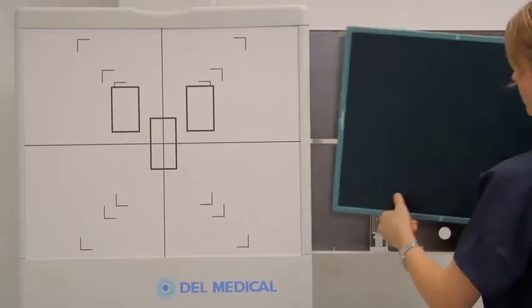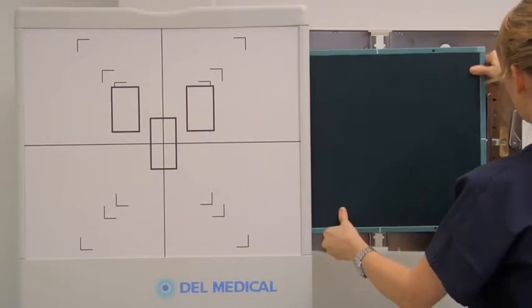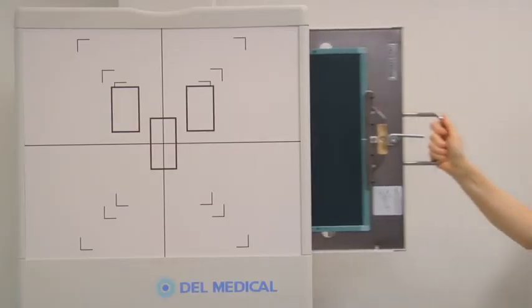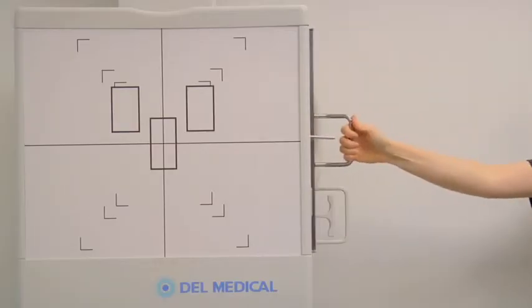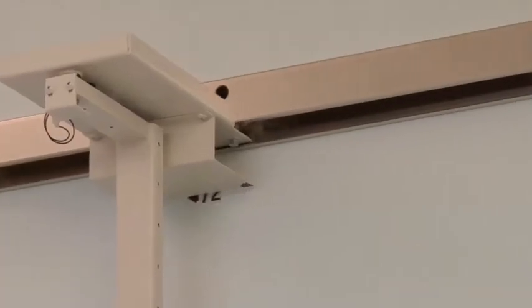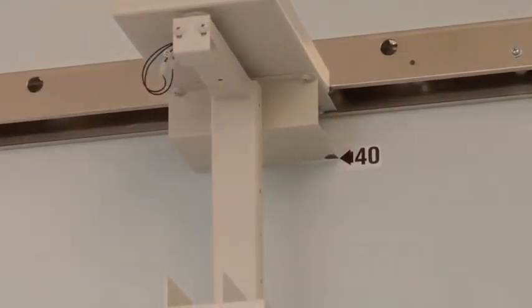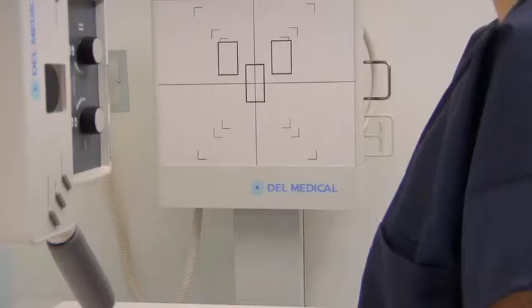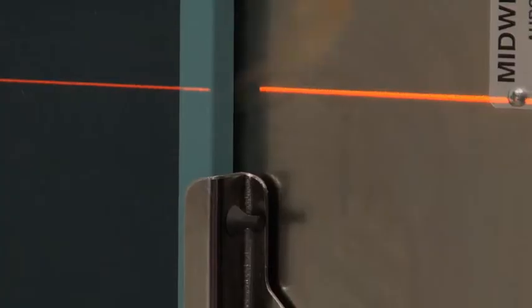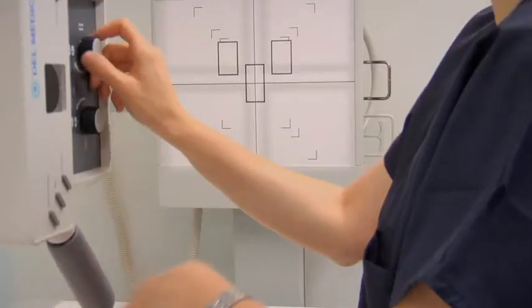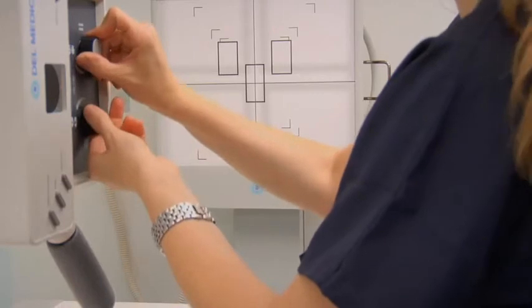To obtain a radiograph of the bilateral upper ribs in the AP projection, begin by selecting a 14-by-17-inch cassette and orientate it crosswise in the upright bucky. Set the SID to 40 inches. Turn on the collimation light. Align the central ray with the middle of the image receptor. Collimate to the cassette size.